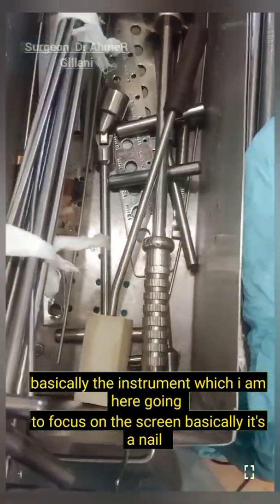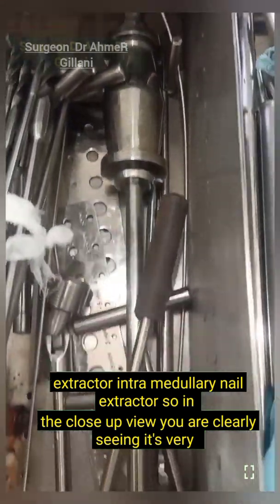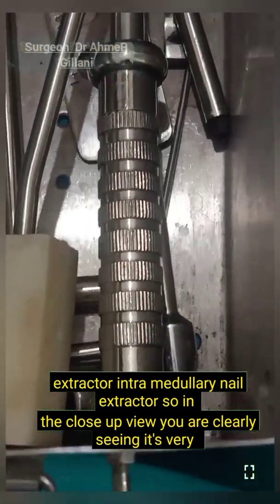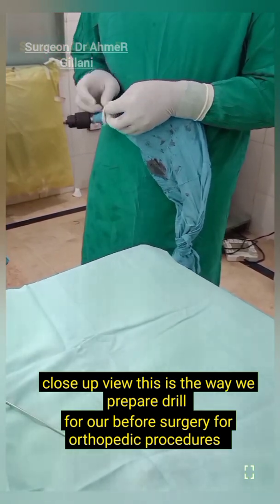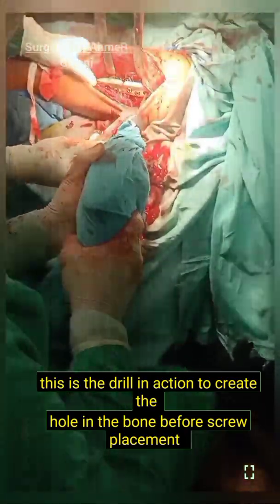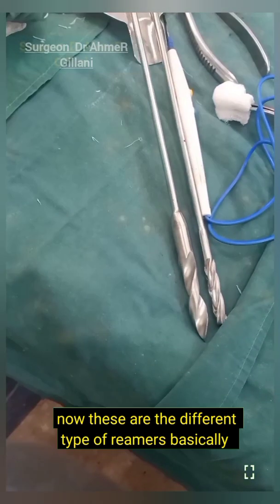The instrument I am going to focus on now is basically a nail extractor — an intramedullary nail extractor. In close view, you can see it very clearly. This is the way we prepare the drill before surgery for orthopedic procedures. This is the drill in action to create a hole in the bone before screw placement.